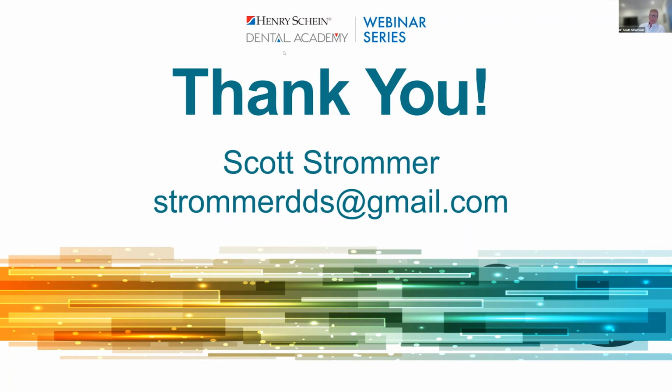The short answer is yes. And then you would let your technician know, because really it's about the centric stops that you're at, and then they're going to make everything pretty. Obviously, the lab is going to take much more time defining the restorations and putting in the anatomy that you want. So yeah, that's a great point. And yes. All right, thank you.